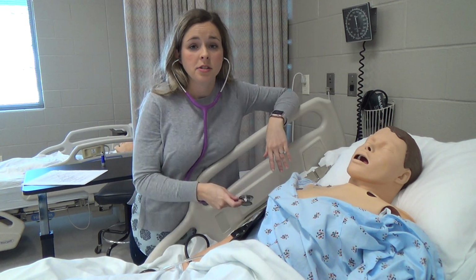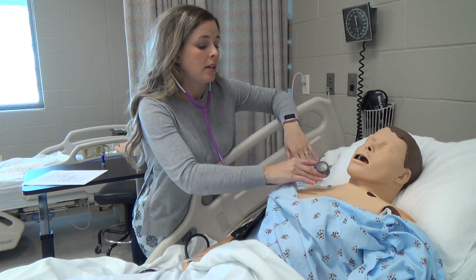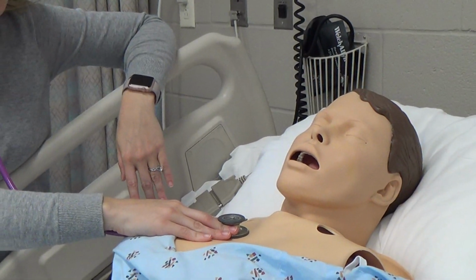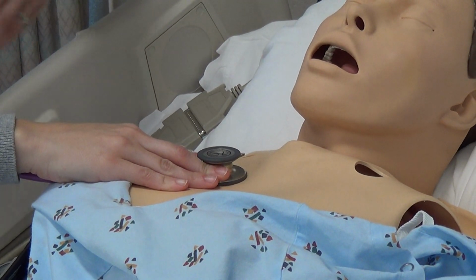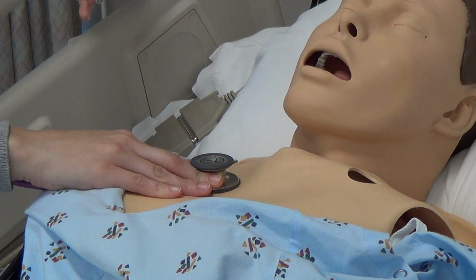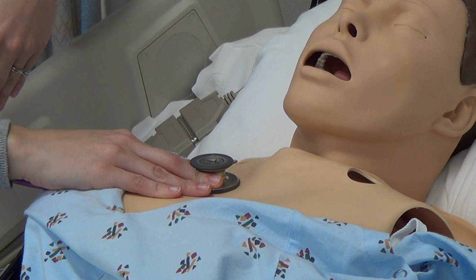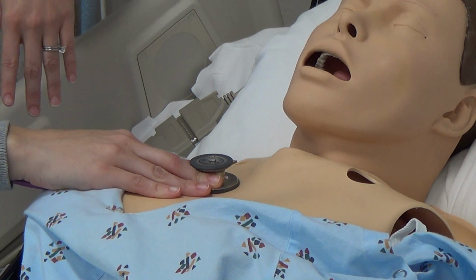And the first sound I'm going to listen to is the aortic valve, and that is located at the second intercostal space right of the sternum border. I'm going to listen just for 4 or 5 beats. I want to assess the rate, the rhythm. I'd want to listen for that lub-dub sound, which is also your S1, S2. You'd also want to make sure that the heart rate was regular, that it wasn't irregular.